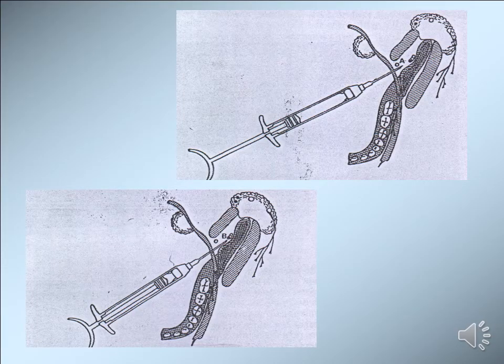This figure shows how to insert the syringe from the opposite side of the mandible between the first and second premolar and parallel to the lower occlusion, and reach the pterygomandibular raphe, then insert it until you reach the bone, as you see in this figure.